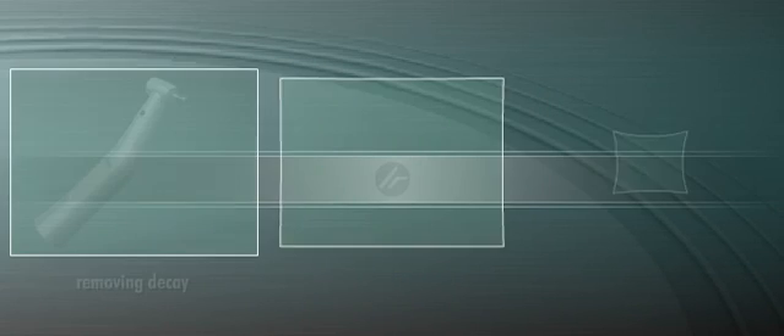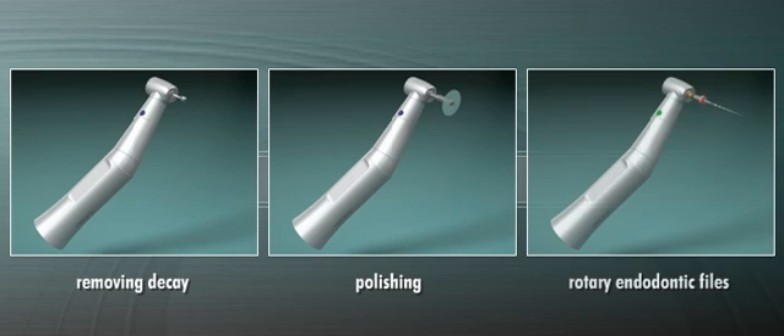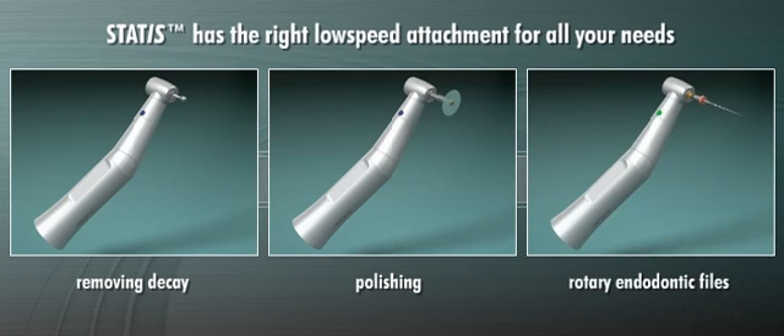Whether you're removing decay, polishing a tooth surface, or using rotary endodontic files, STATIS has the right low-speed attachment for all your needs.